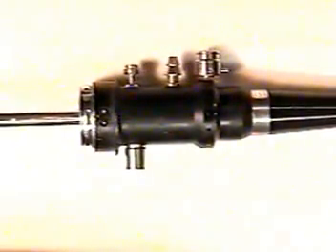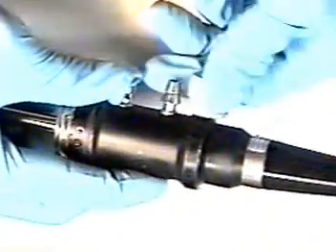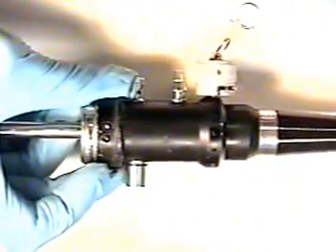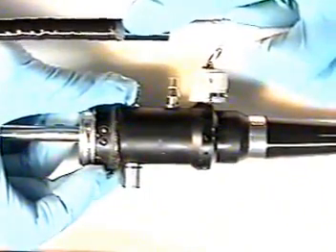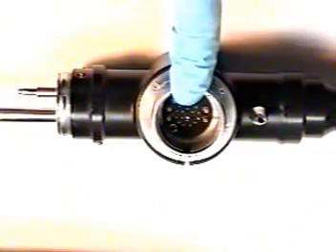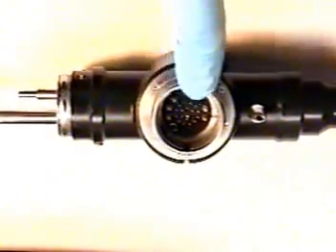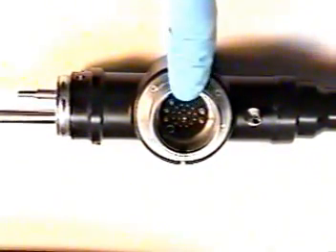If you're gluing a fiber scope, it will be necessary to use an ETO cap evacuator. This equalizes the pressure in the endoscope, so when we make a glue binding, bubbles do not form underneath the glue. If you're gluing a video scope, it will not be necessary to equalize the pressure. The reason is that when the ETO cap is off the electronic connector, the pressure is equalized because air is allowed in and out of the endoscope with the ETO cap off.